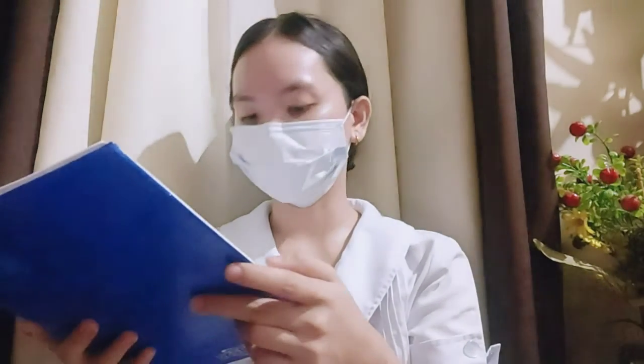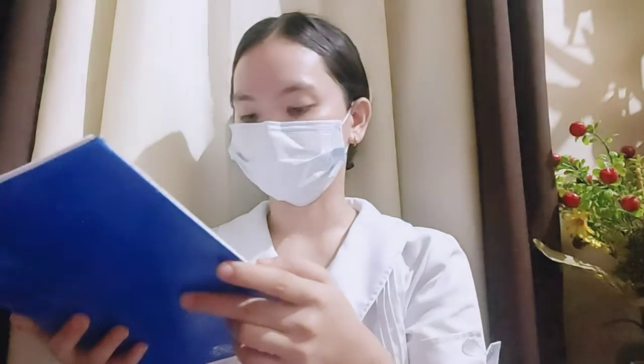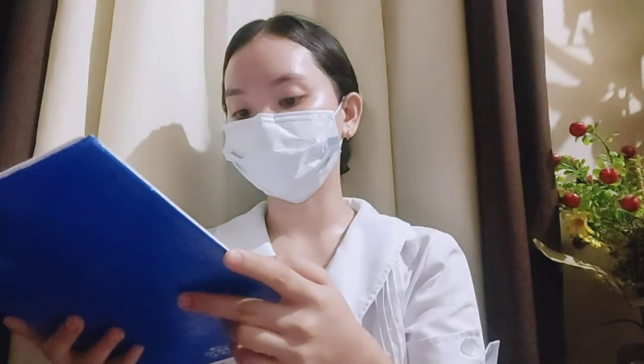Patient remains free of any signs and symptoms of aspiration. Patient rates pain as decreased from before insertion. Patient verbalized an understanding of the reason for nasogastric tube insertion. We are done with the evaluation, and now let us proceed to the documentation.